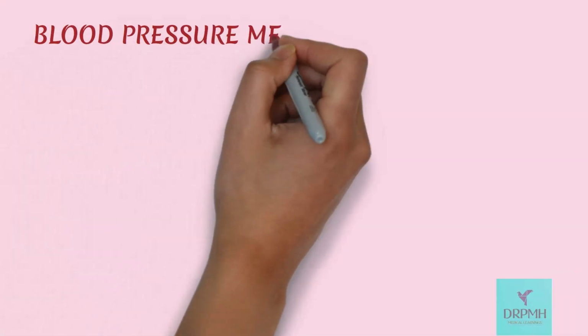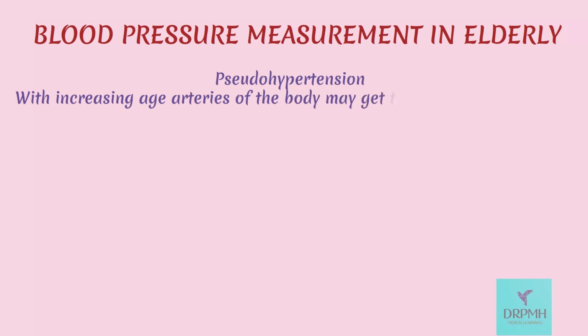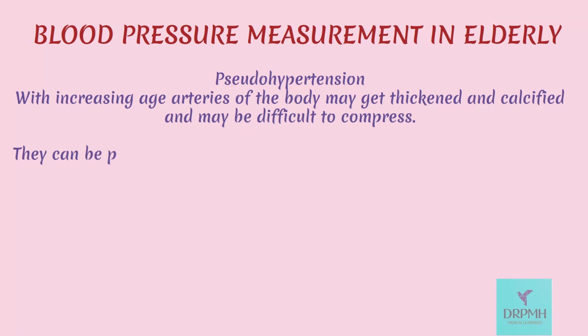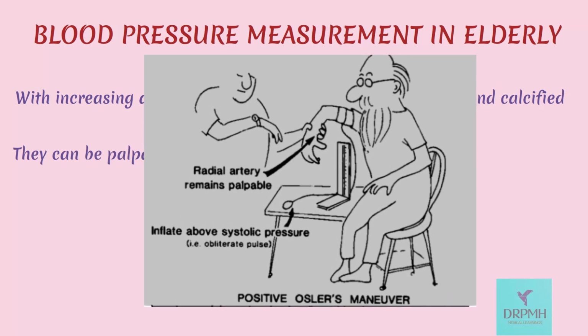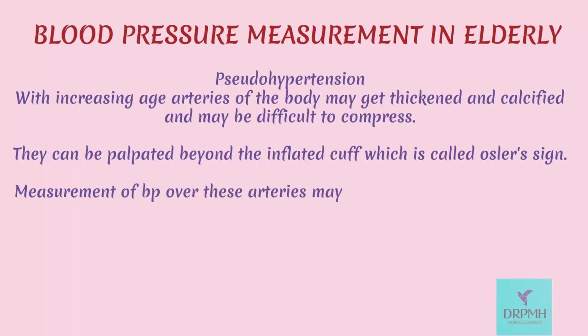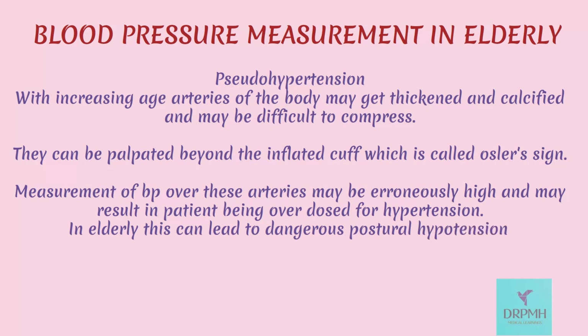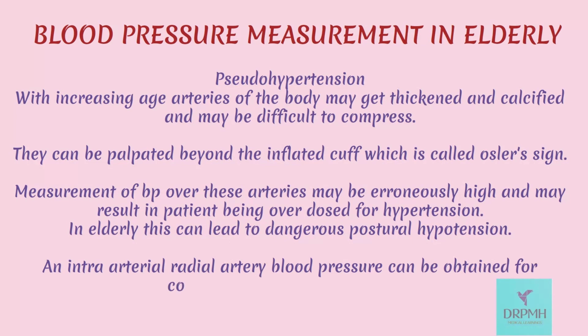Last but not the least, blood pressure measurement in elderly. Pseudo-hypertension. With increasing age, arteries of the body may get thickened and calcified and may be difficult to compress. They can be palpated beyond the inflated cuff, which is called Osler's sign. Measurement of BP over these arteries may be erroneously high and may result in patient being overdosed for hypertension. In elderly, this can lead to dangerous postural hypotension. An intra-arterial radial artery blood pressure can be obtained for confirmation in such a situation.